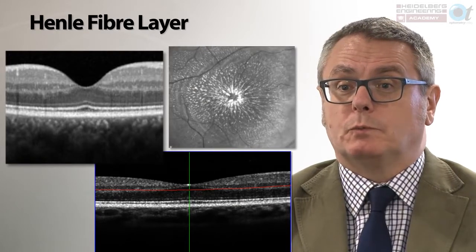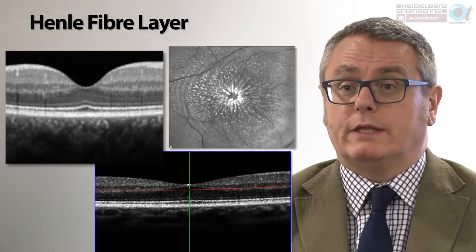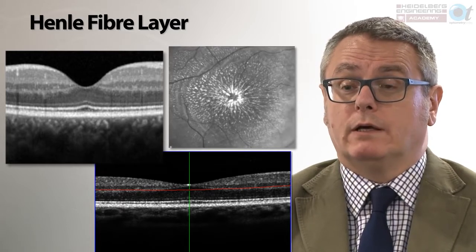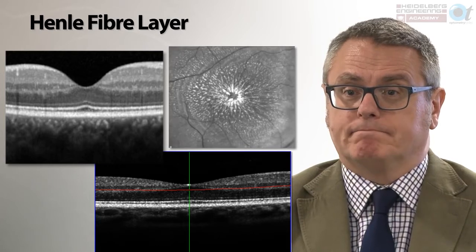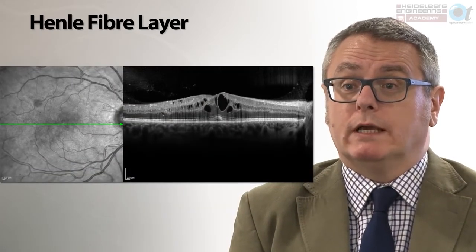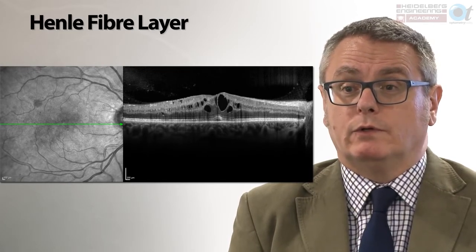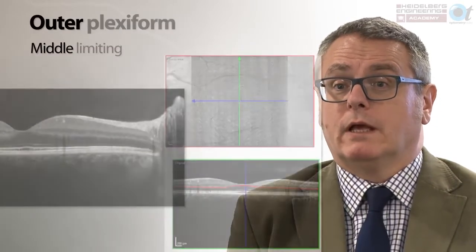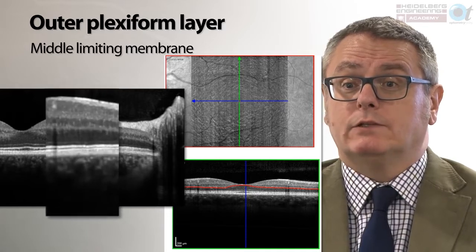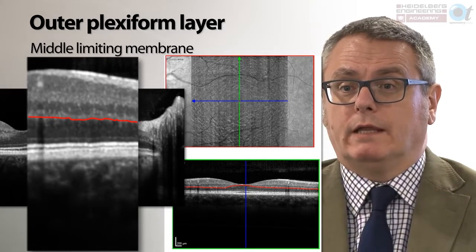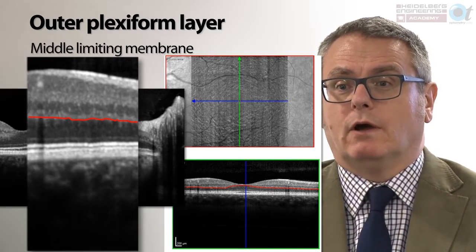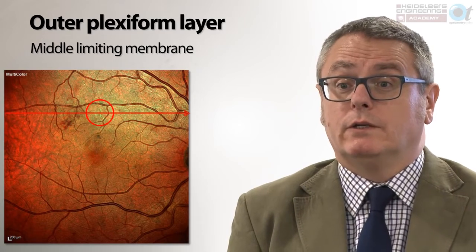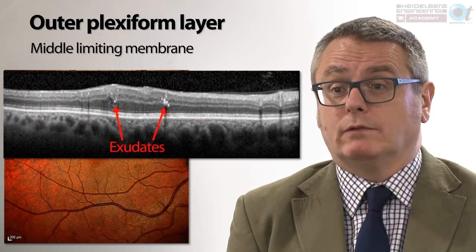Within the outer nuclear layer it is possible to perceive another band — Henley's fibre layer — where the inner fibres of the photoreceptors taper away to form the foveal depression. The image on the right shows a patient with a macular star where exudate follows the radial pattern of Henley's fibre layer. Henley's fibre layer is important because in retinal vascular disease, intraretinal fluid or retinal cysts form in front of it. The outer plexiform layer forms a middle limiting membrane, and exudate will not pass beyond this position. The high magnification OCT cross-section confirms exudate at the level of the outer plexiform layer.